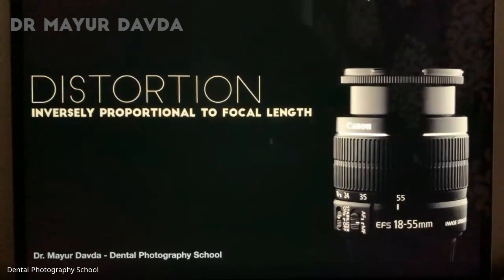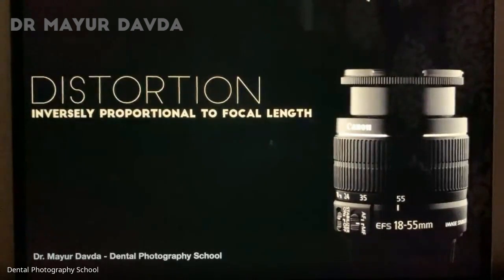Since we are documenting our cases, we definitely do not want distortion happening in our publications and even in our records. So distortion is something that you definitely don't want to have in dental photography. Make sure that you don't use this lens for documentation purposes.